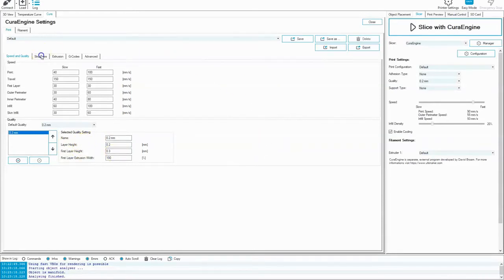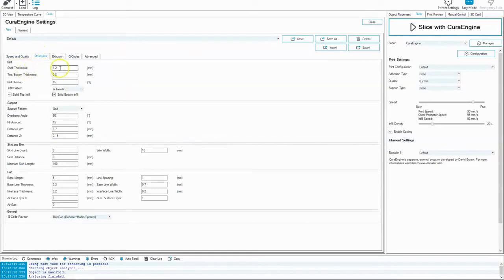So from that point, I'm going to move over to structures. Looking at shell thickness, I increased my shell thickness to 1.2. It gives us a slightly thicker shell, actually 3 layers of material around the outside. And the top and bottom thickness, I have also made sure is set to 0.8 so that we have a nice thick top and bottom.